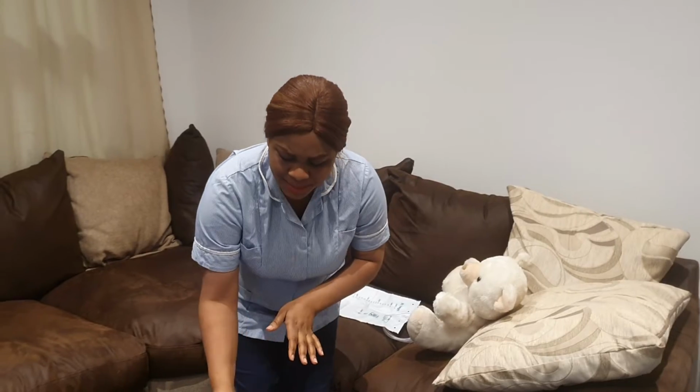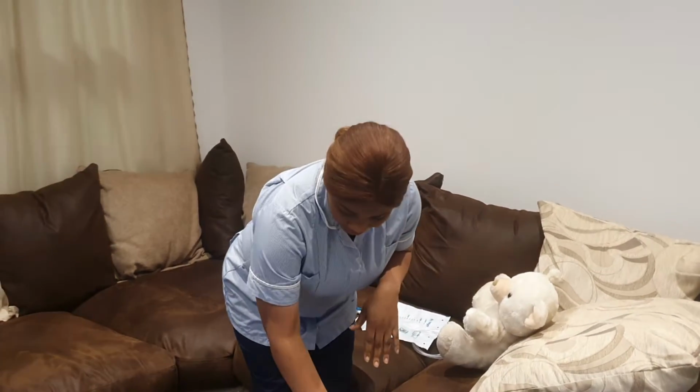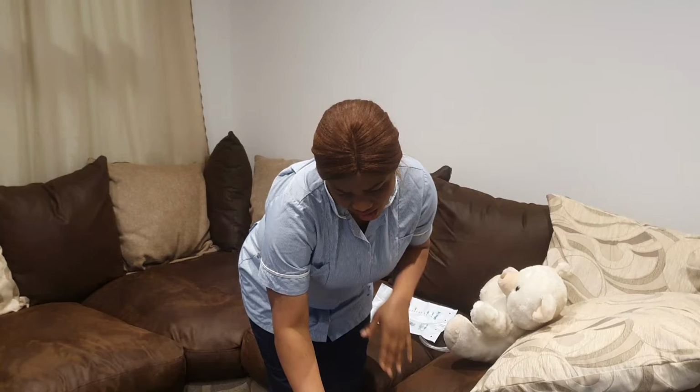Now this is my sampling bottle. This sampling bottle is sterile. Mine does not have an expiry date, so check yours. Some have an expiry date. So this sampling bottle is sterile and I'm happy to use it. It's still valid. All right, now I'll be needing my syringe, guys.